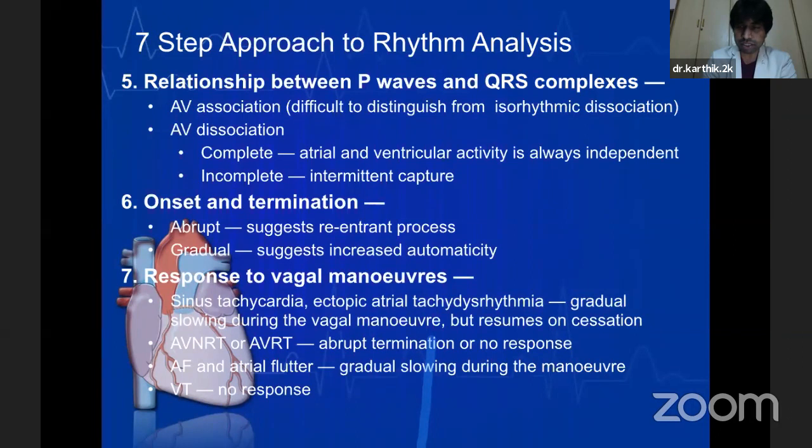And the sixth point that you should understand on these ECGs is sometimes, especially when you come across a patient with a supraventricular tachycardia, as soon as you diagnose, you may be looking at the ECG and suddenly the tachycardia may disappear, or suddenly the tachycardia may reappear. So these kinds of behaviors on an ECG, when documented, become very important for the diagnosis of the entity.